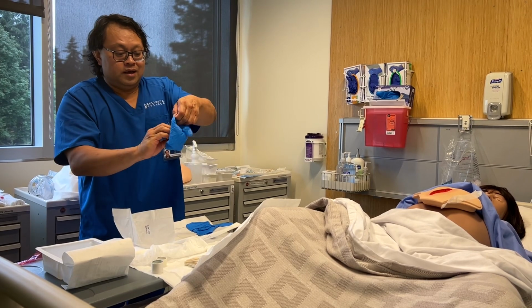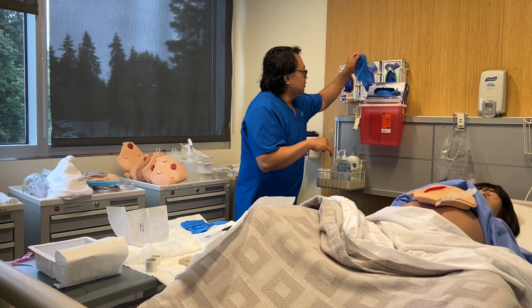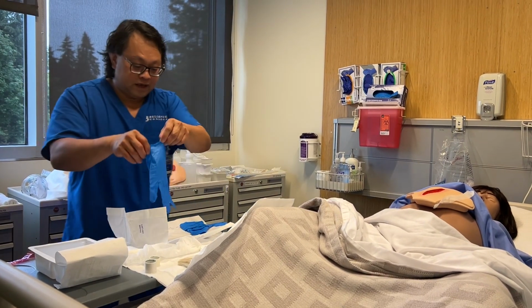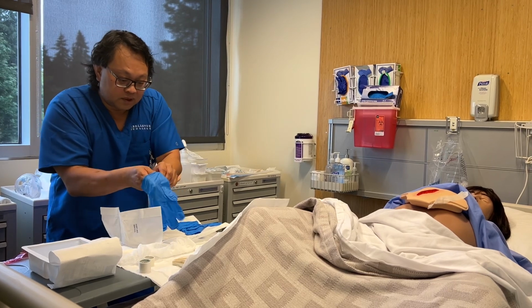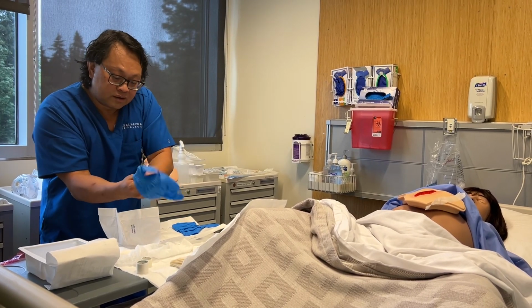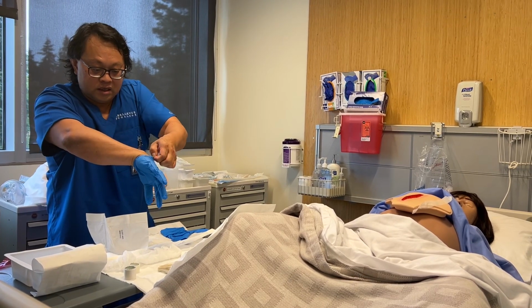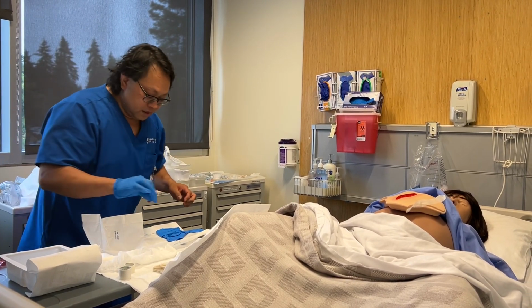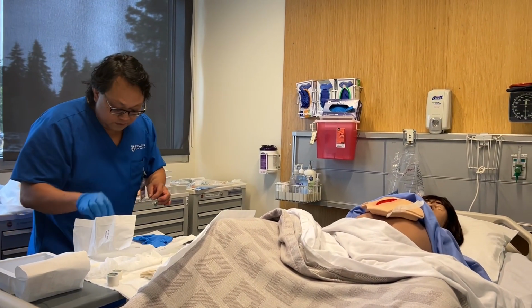Put it on the wrong way. Sorry, do over. Put it on. Oops, my hands were too wet. Okay, so I'm not going to touch the gloves. I'm just going to touch at the edge here. There we are. Again, on this side, this time I'll put it on correctly, hopefully.